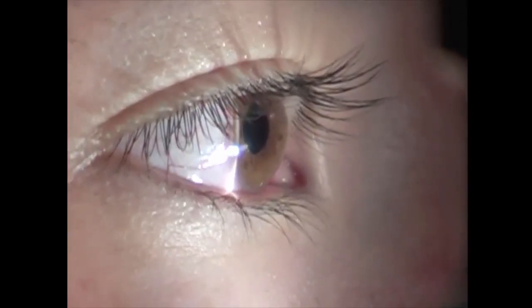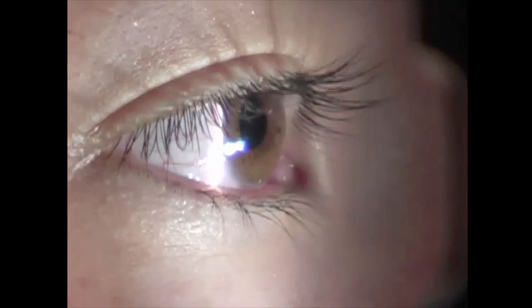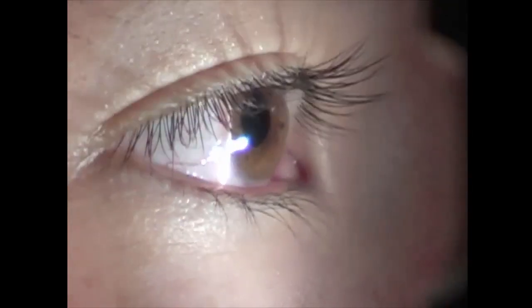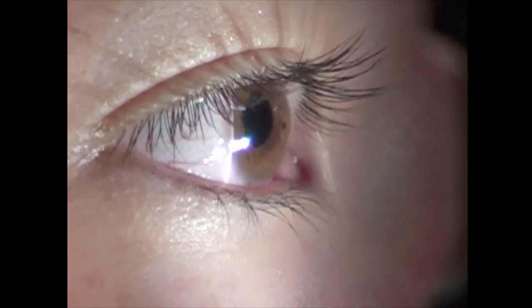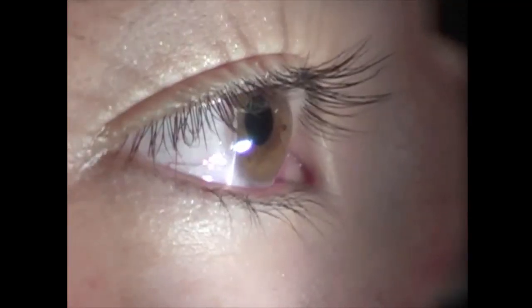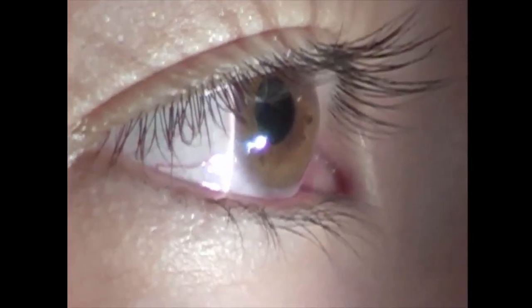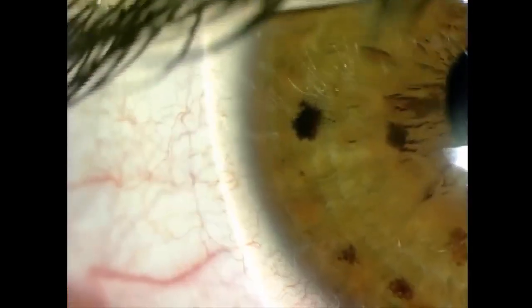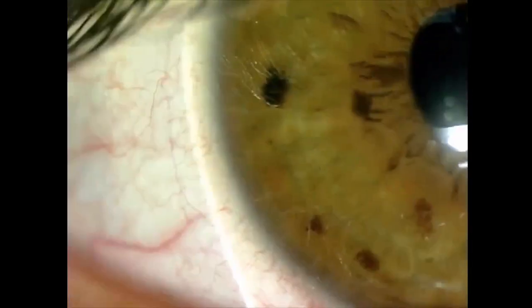So we're coming in a dark room with a very thin beam of light coming from the temporal side. I show this because I've had people describe that they're doing the Van Herick over the pupil. That is not correct. So I bring the beam in until I just barely find the anterior chamber, like that.